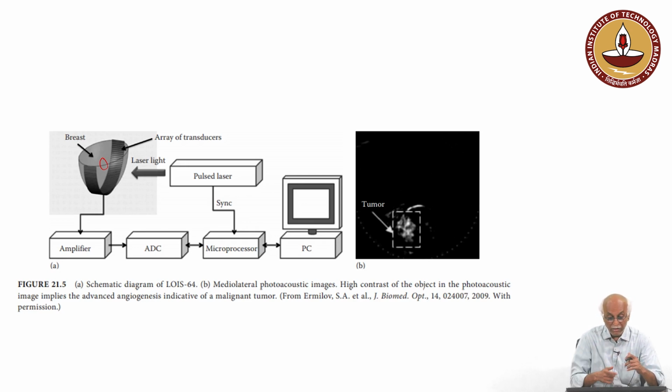So, if it is not only imaging that we want to do, but to capture the differentiation between different tissue structures within that imaging area, then for that purpose we need something more, not only to acquire this signal as a photoacoustic amplitude, but to capture some spectral information, so that the ultrasound spectral information can provide us something more about the tissue characteristics.